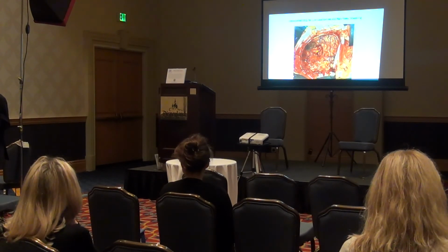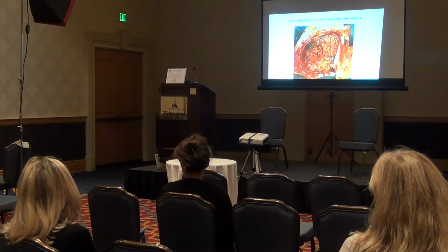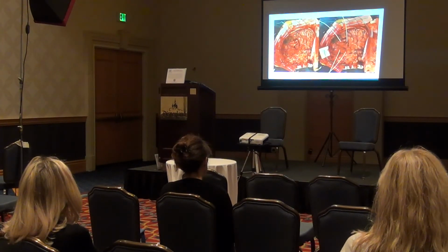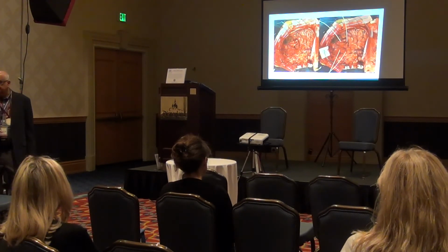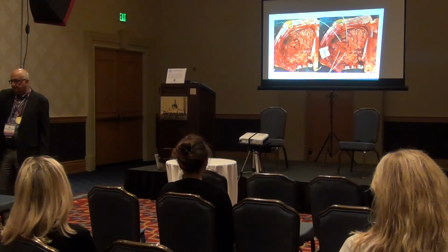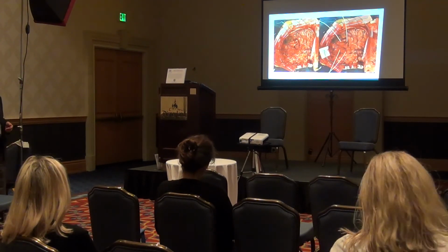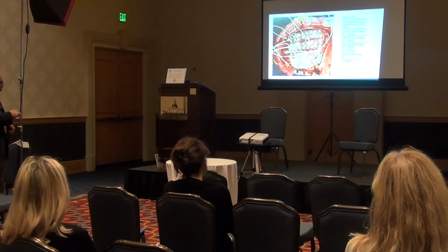The family lives in Perth, so they sent them right back to us because we are good at doing some elaborate things that I'm going to show you. So here, you can see we're beginning to put electrodes. These are called depth electrodes. They go deep, and they have several contacts along the way. So each one could have 4 to 6 contacts, sampling other than the surface. Then over here, you see the depth electrodes like this going down.